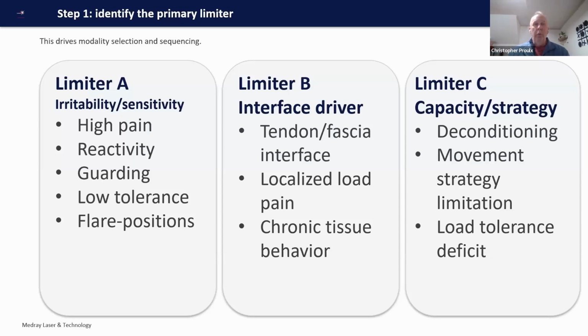Okay. And so with radial extracorporeal shock wave, remember that that energy density is going to be highest at the surface, right at the applicator as you put it on top of that patient. And by the way, also within those dermal layers and subsequently below that, there's a lot of free nerve endings. And so they may not like being touched or poked or hit with something that is overly pressurized and mechanical.